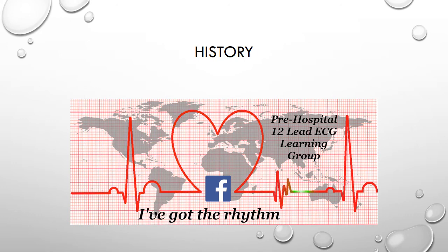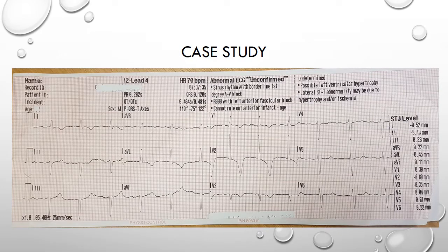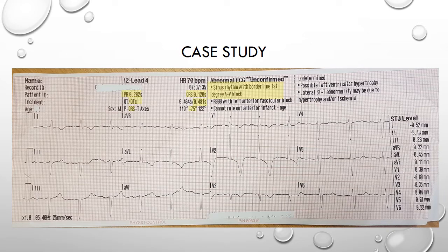So should you bother with an ECG? Well in this case we did. The rate is about 72 and is sinus in origin. There is a slightly long PR interval of just over 200 milliseconds as measured by the computer, hence the borderline first degree block. Axis is leftwards. The QRS is wide at 120 milliseconds and the QTc is prolonged. We have a dominant R wave in V1 with widespread secondary ST wave changes.